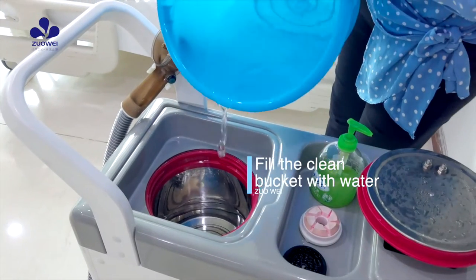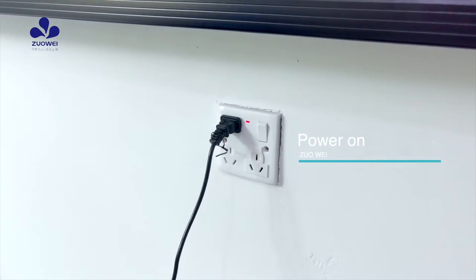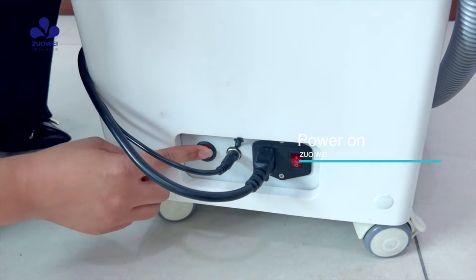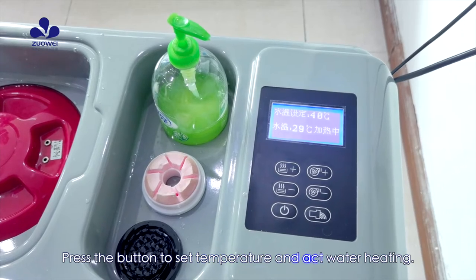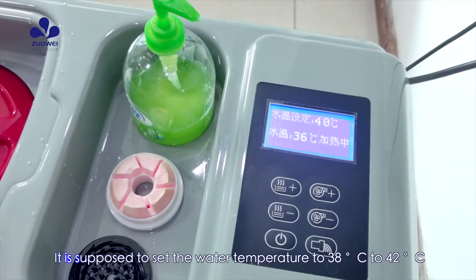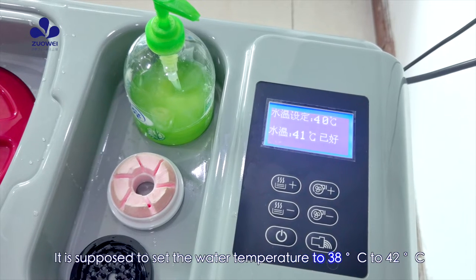Fill the clean bucket with water and power on. Press the button to set the temperature and activate water heating. It is recommended to set the water temperature between 38°C to 42°C.